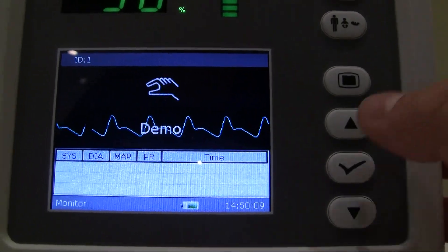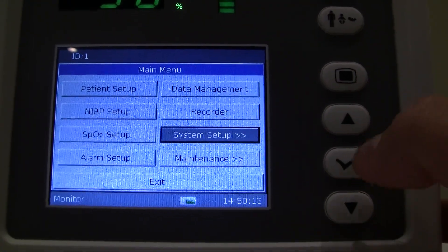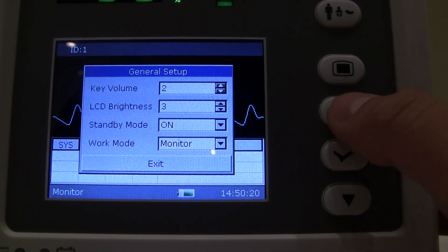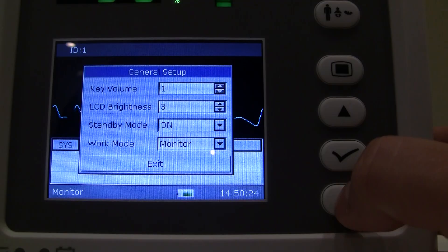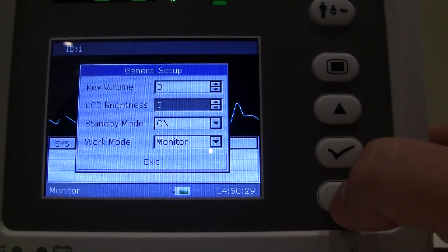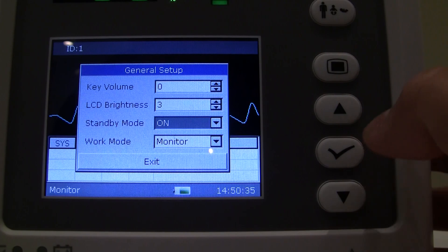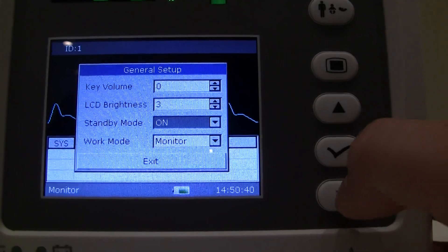The unit can be set up to user's preference. Going to System Setup and general setup options: key volume — I have that turned down right now, but you can select it to make a noise every time you press the keys. LCD brightness can be changed there. Standby mode is on, meaning that if you hit the power switch, it will ask if you want to keep the monitor in standby mode so it boots up quickly for your next patient.